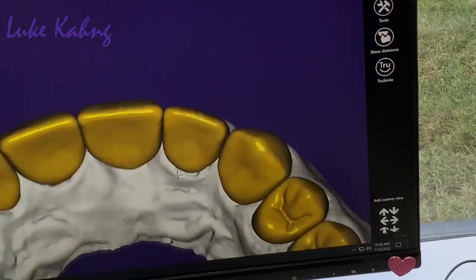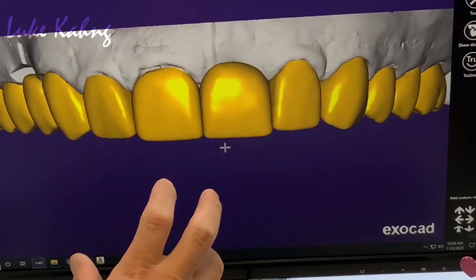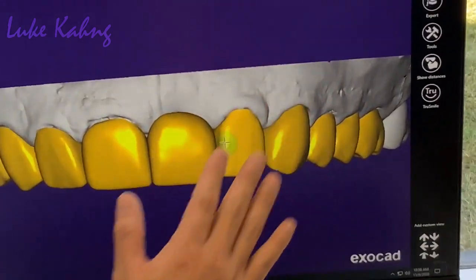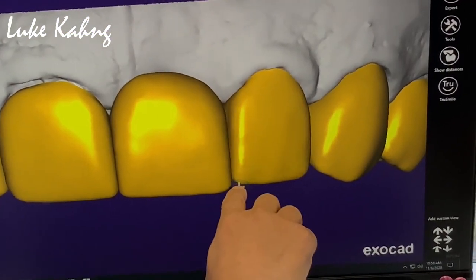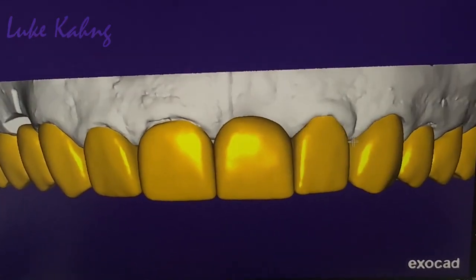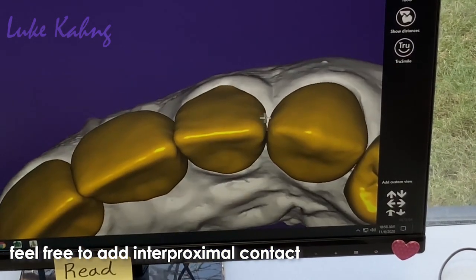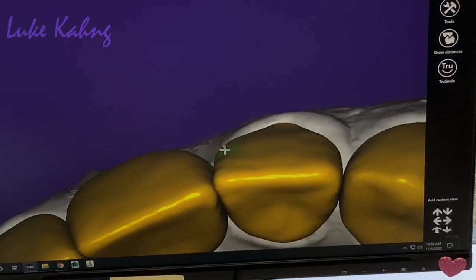Okay. Now look at the central, frontal view. Bigger. This is good shape. This is too much like this. I will make it like this. And then you add here a little longer. Feel free to add the interproximal contact. Just make it slightly fat, it's okay. Yep.